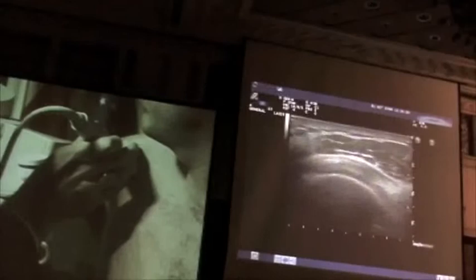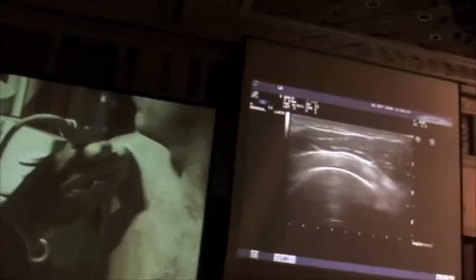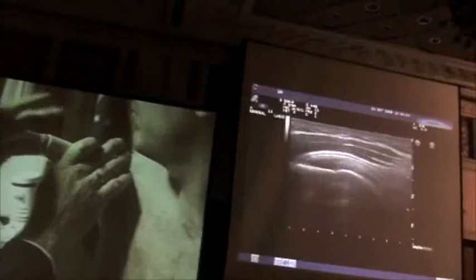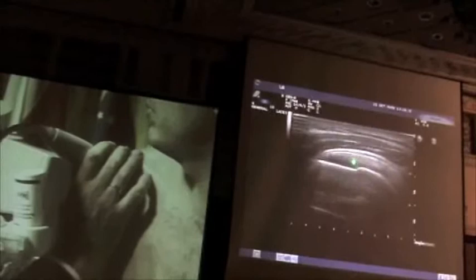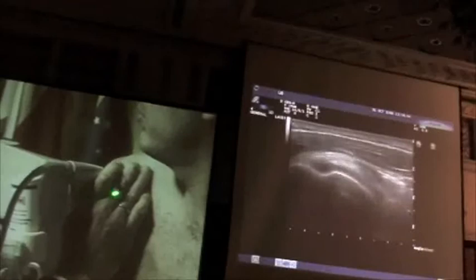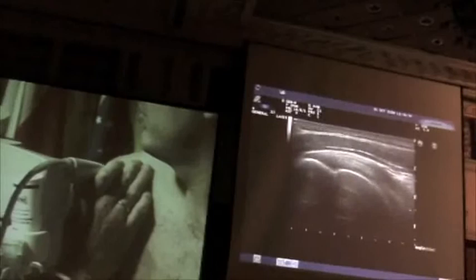You scan up to the acromion and then scan down, again keeping your transducer perpendicular. Now, the most important portion of the rotator cuff — if you look longitudinally, changing to the longitudinal orientation while scanning the supraspinatus longitudinally — most of the tears are going to be over the critical zone, which is about over the anatomic neck of the humerus, about a centimeter from the biceps tendon. So again you make your sweep until you see the intracapsular biceps tendon, then sweep about a centimeter lateral to that point. That's where you see most of the rotator cuff tears, very close to the tuberosity.